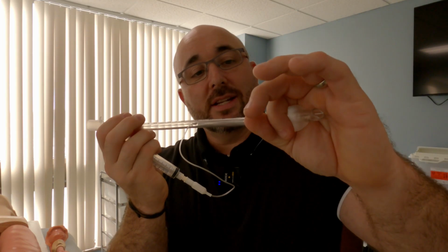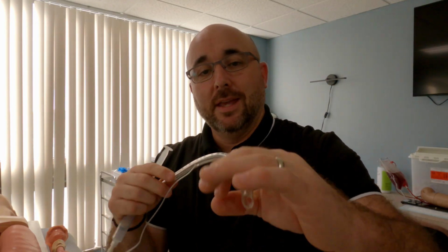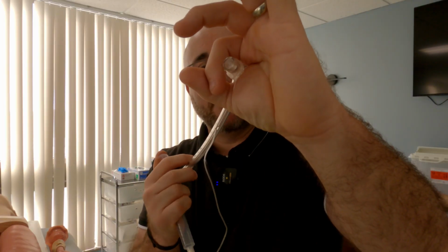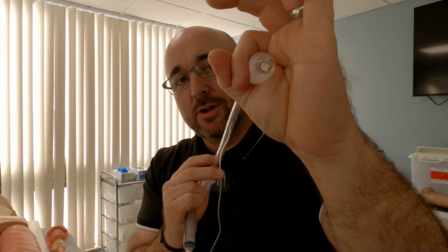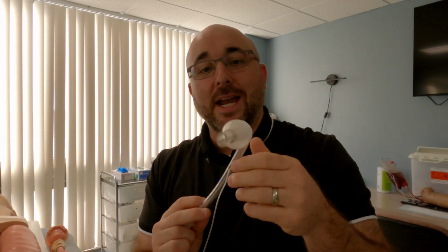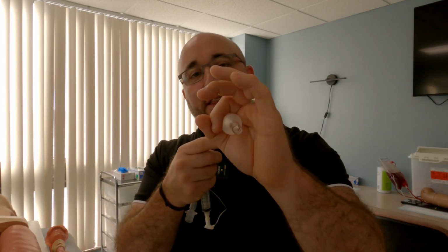You don't have to put a bunch of air into it, because technically it's not going to blow up that large. It's going to seal in an airway. And so it's going to go from about like this inside the airway. This is a good representation. You're not even going to have to put a full syringe in usually, and it's going to close it off. So just because the cuff doesn't look like it's real big and tight, that's okay. This isn't like a Foley catheter that you're going to fill up and has to stay in there. This just has to seal in the airway.